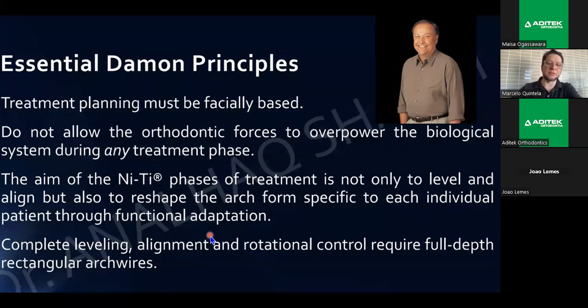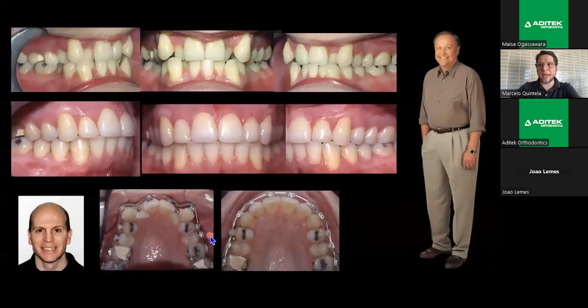We treat until 19x25, for example. Even in adults, Damon allows that we can obtain dentoalveolar remodeling with the application of light forces in a low friction system, enough not to obliterate blood vessels that maintain the necessary oxygen supply. Remember that tissue necrosis results from the high forces using conventional techniques to move teeth with friction, with elastics, elastomerics. So the proposal is to do it differently.